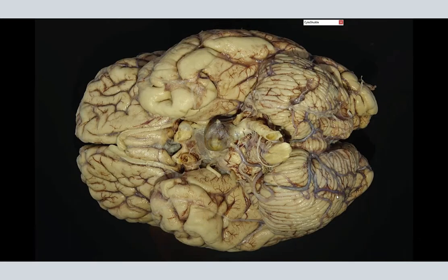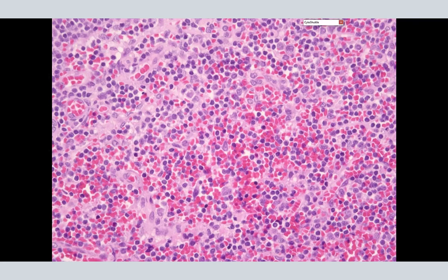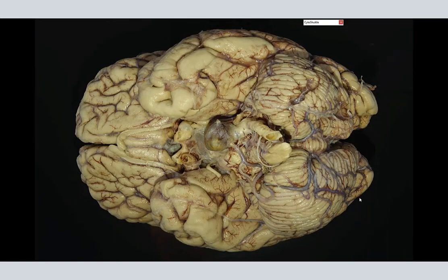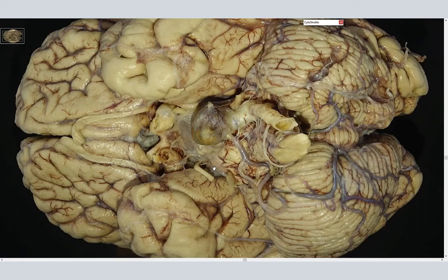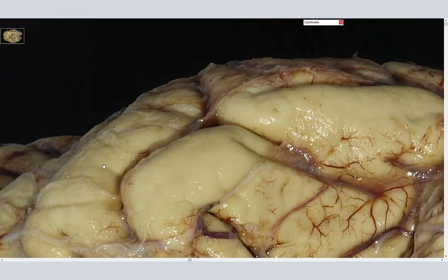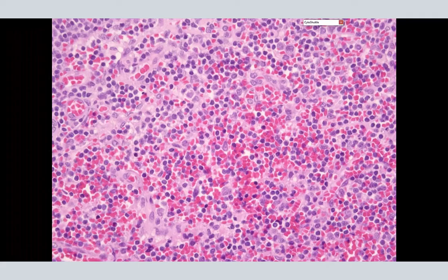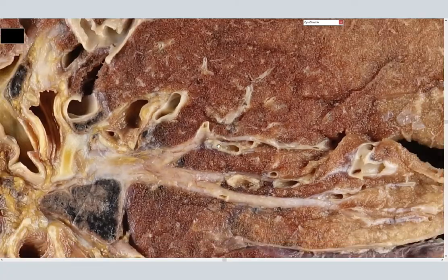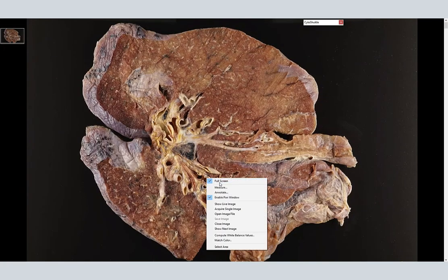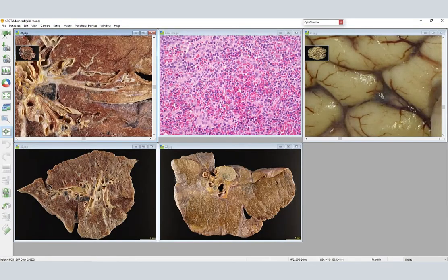Just using the keyboard commands, I can walk through my images. On any image that I stop on, I can use all my regular tools, basically show various other images. These are our grossing images. And then to get back out of full screen, I can just pop out. And those are the images that I had up there and was showing.